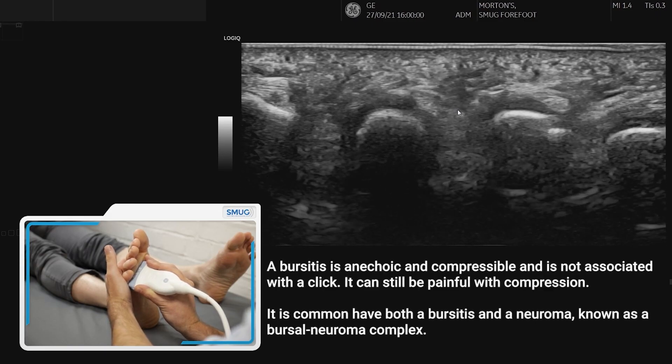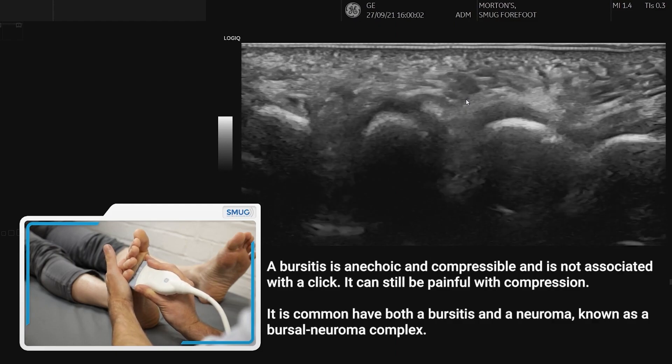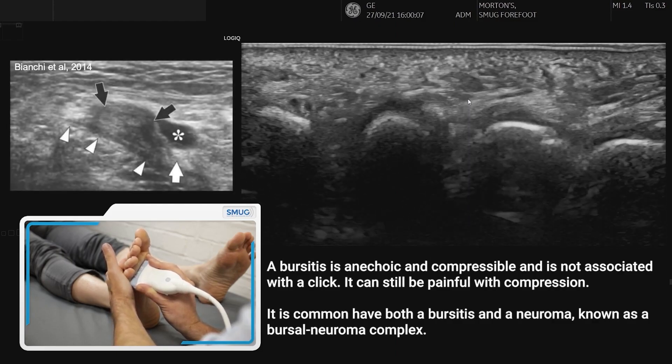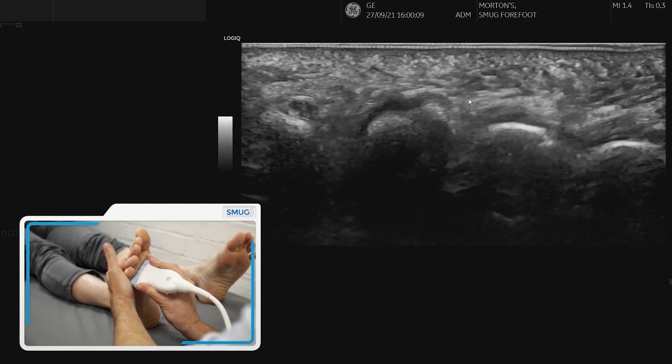If it's anechoic and compressible then that's more likely to be a bursitis, but often — and in fact very commonly — they occur together as a neuroma-bursal neuroma complex.